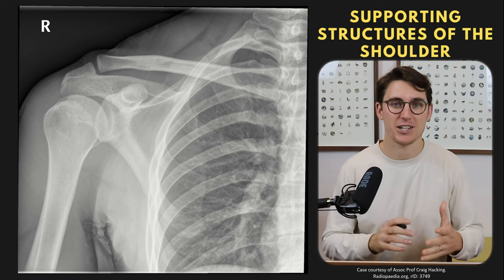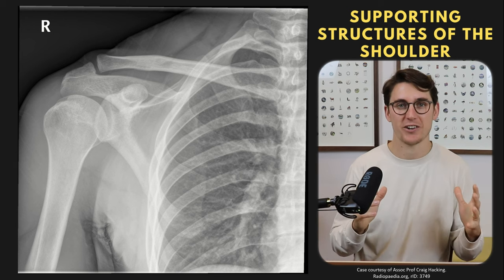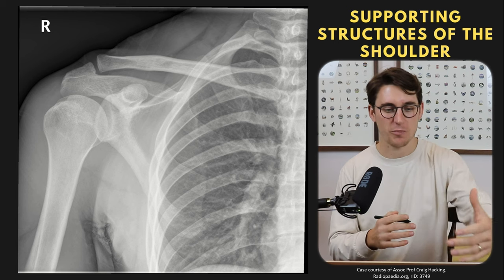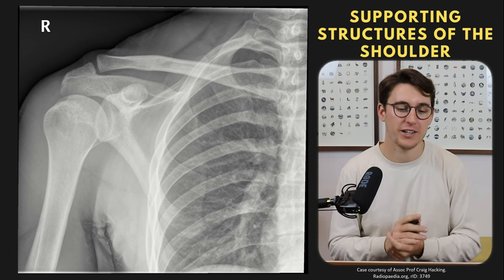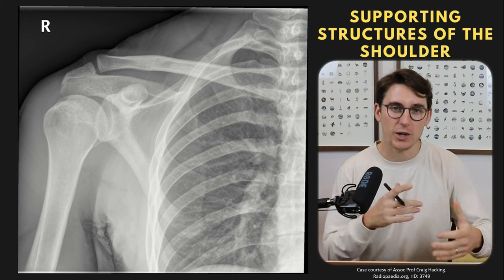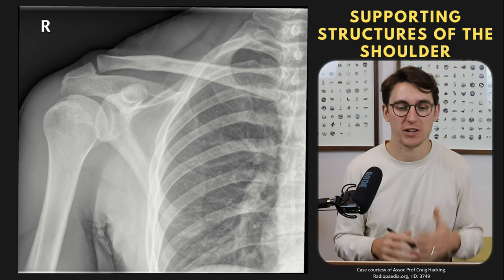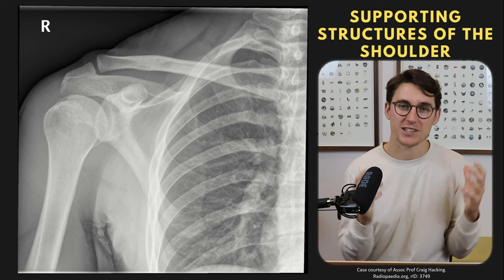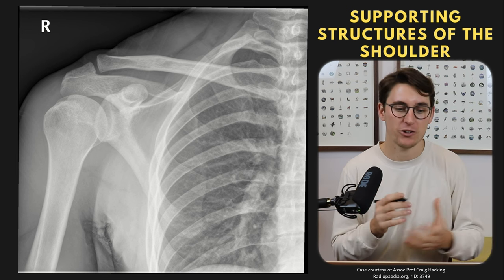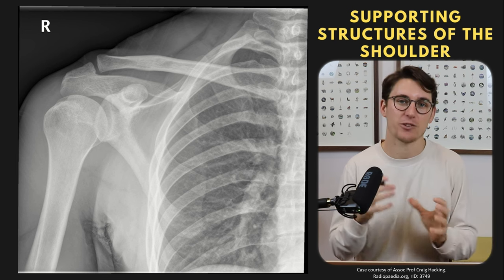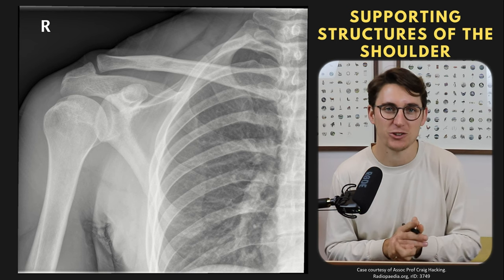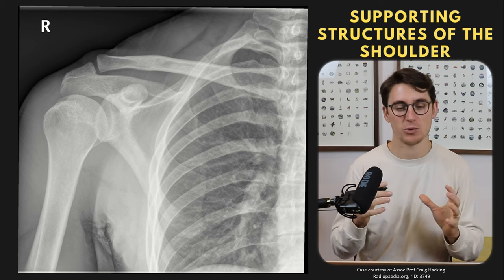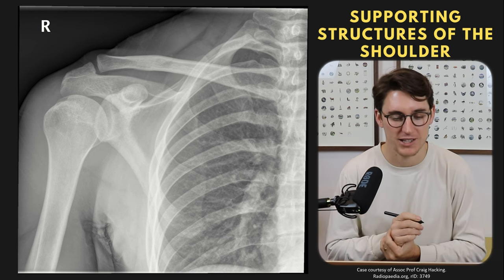The great thing about an X-ray is you can see the joint in its entirety — not just a single slice — and we can see all the structures from anterior to posterior overlaid over each other. We're going to approach each MRI by firstly looking at the bones, then the ligaments, moving on to the capsule and labrum of the glenohumeral joint, and lastly the rotator cuff muscles surrounding the shoulder. Let's identify those structures on the X-ray first.